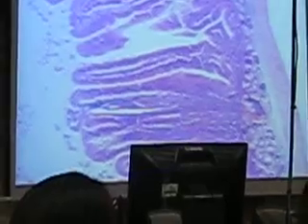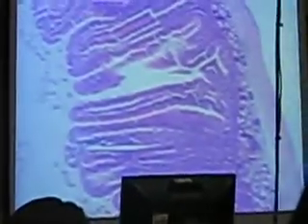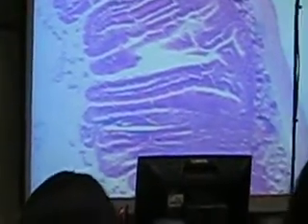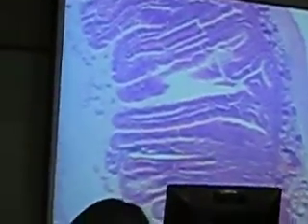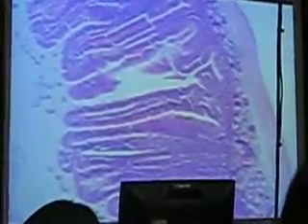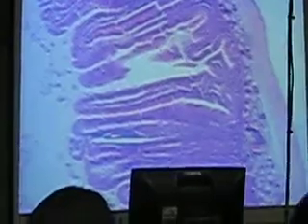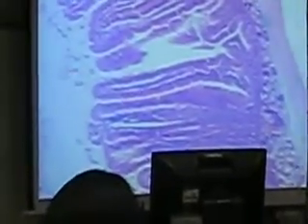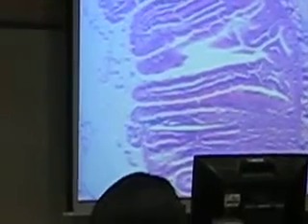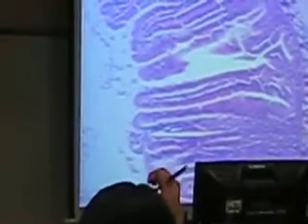If I point right here and ask what the epithelial tissue of this structure is, then you should know that. But if I want you to visualize the actual tissue, then I'll have to go up to high power. Most likely, just to identify the region, I'd say on low power you'll be able to see the villi and also the Brunner's glands. So, low power most likely.